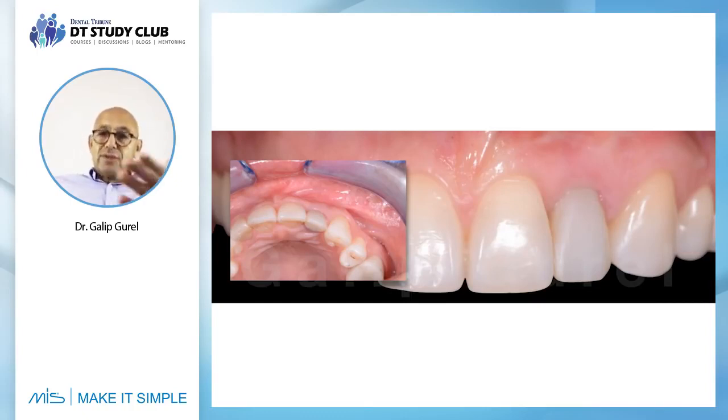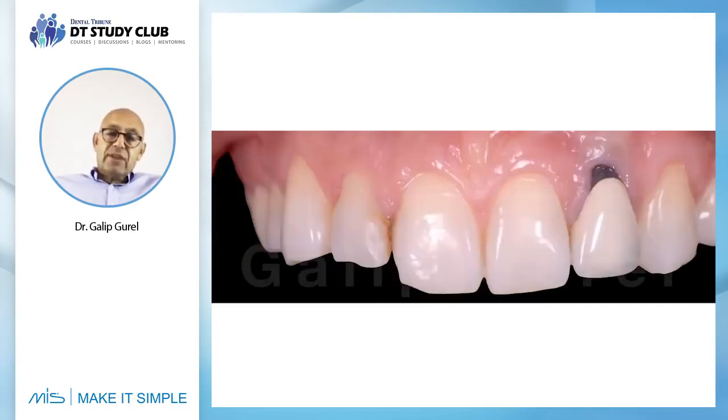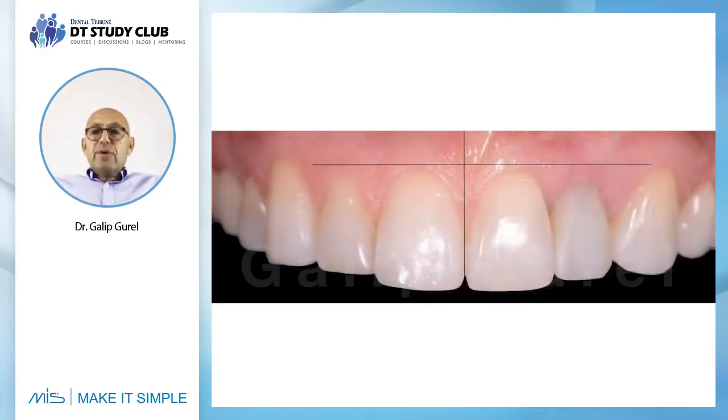The main goal was to set this, but when we want to see the difference between the beginning of the case and this final, look at the position of the teeth. This is the true midline, all the way shifted. This is the vertical line. You see the zenith of the lateral showing through, and when we superimpose it with the final, look how much space we gain and make these equal with the other lateral.